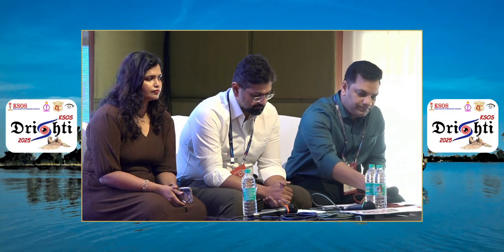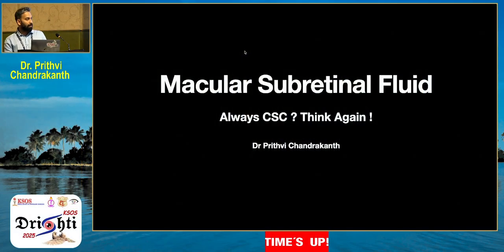Thank you, Dr. Shishir, for having me here. I'll be talking about macular subretinal fluid. Could it always be CSC, or think again?